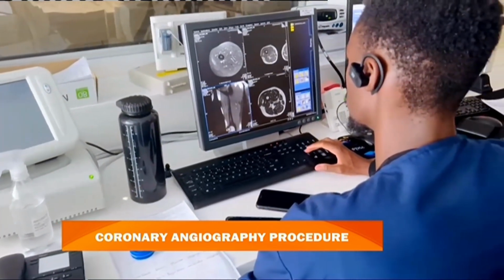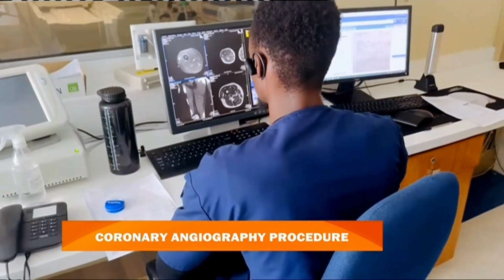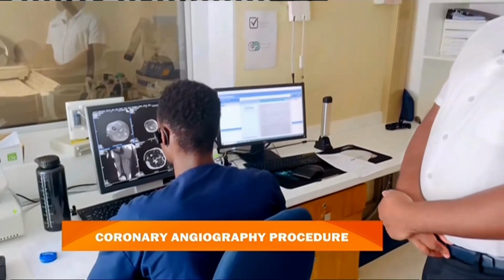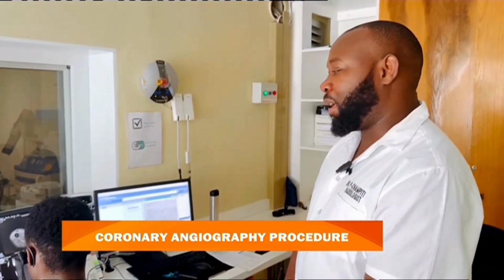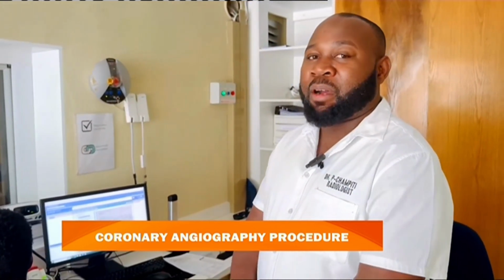But because we have improved from the previous models to the current ones, there are actually ways and means of protecting those medical implants that people may have. So the heart pacemakers, the nails that people are given after they have broken bones, joint replacement. So those people are now able to come and be diagnosed on the machine if it is actually needed for them.